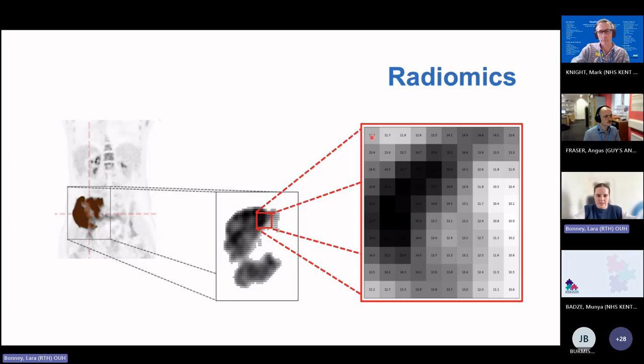There's just lots and lots of numbers in each different pixel in the image. And from these, we can extract different things. So we could extract something like the maximum signal. So the regions of dark in this image are where the signal is higher. But we could also extract other things from this image that might characterize the tumor better.